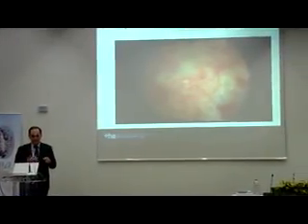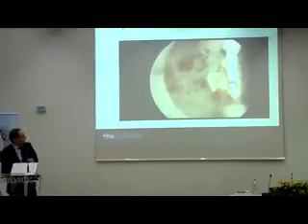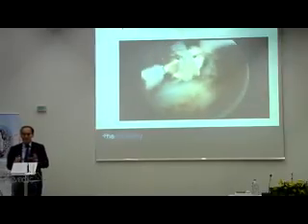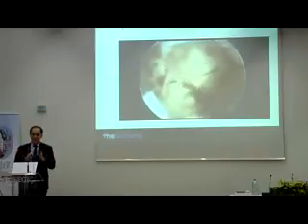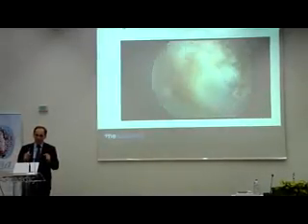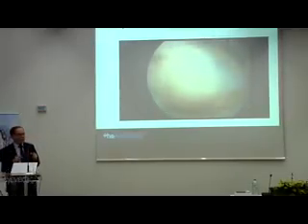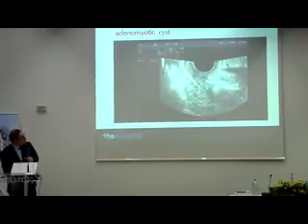Now, here we are in the womb, not in the ovary. So you have the possibility to coagulate. There is also for the ovary, I was at CNGOF, Paris, an absolute recommendation, also in the ovarian endometrioma, not to strip anymore, but to coagulate, but carefully, because you lose the whole cortex if you take it away. And your AMH is... So we did this, and you see how deep we came with coagulation.